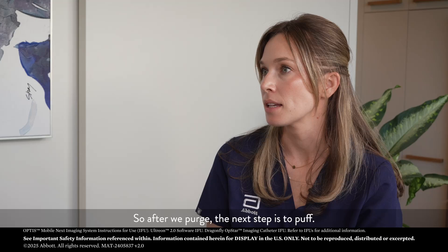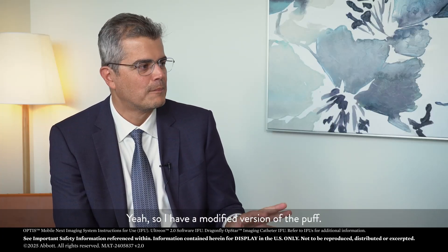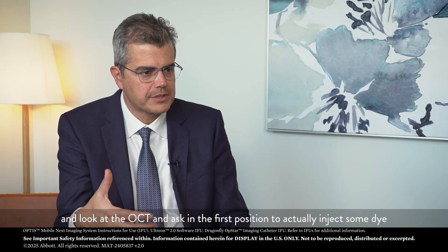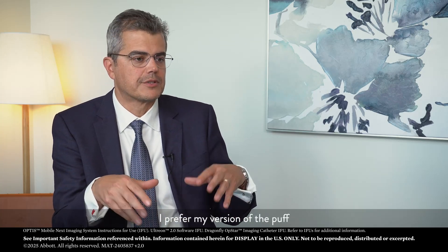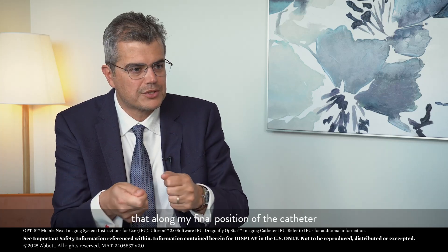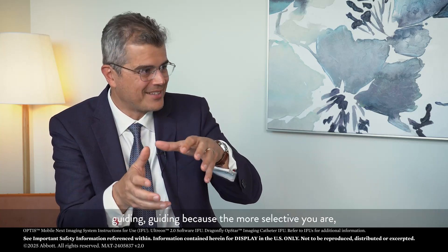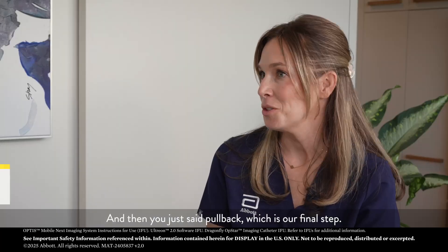After we purge, the next step is to puff. I have a modified version of the puff. The original version is to go live on the OCT and look at it, asking in the first position to inject some dye through the guiding to see if you achieve clearance. I prefer to look at the angio, not the OCT, and use one or two cc's of dye just to confirm that along my final catheter position, I didn't disengage my guiding catheter. Because the more selective you are, the better your pullback image quality will be.